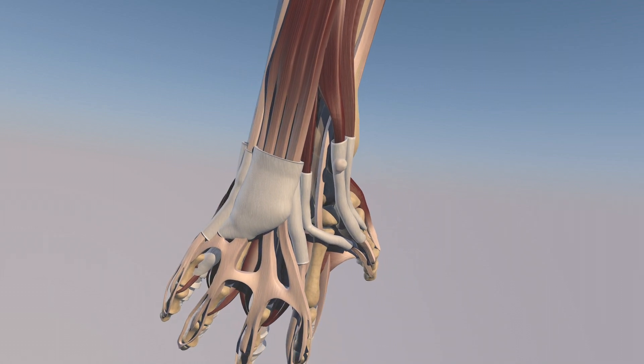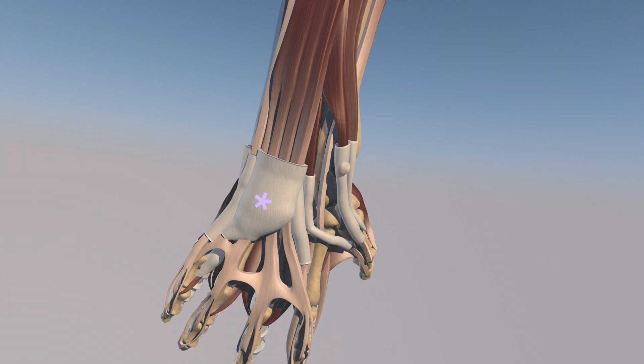Now we're just rotating anteriorly, and we can see the sheath surrounding the fourth extensor compartment. Here's the extensor indicis tendon sheath, here's the extensor pollicis longus tendon sheath, and here's the extensor digiti minimi tendon sheath as well.